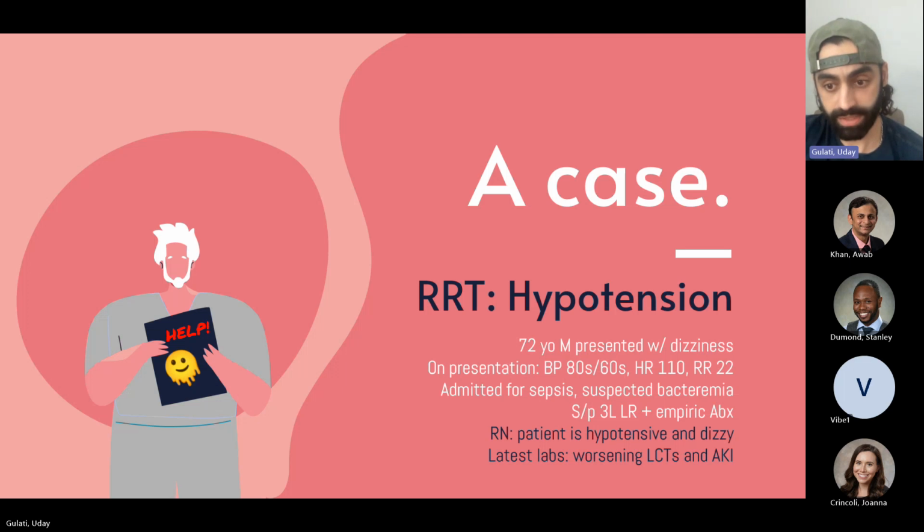I think an ultrasound is very key here. If you guys have had the chance to be rounding with me or be on rapids with me, then you know that no matter who the patient is or what the rapid response is for, I want you to bring the ultrasound into the room. And likely the only time you will not use the ultrasound is if the rapid response is in fact a fake call.